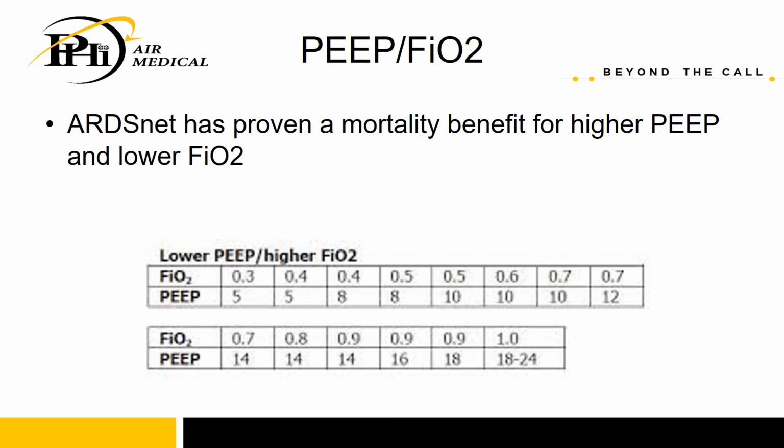However, if you do have some atelectatic alveoli, or you have fluid in your alveoli, or you have a patient who is not taking incredibly deep breaths, there are many reasons, but if you're not keeping volume, keeping air in your lungs at the end of expiration, then you are not going to be oxygenating very well. So adding PEEP is equally, if not more important than adding FiO2, as the benefits of PEEP are far and wide.